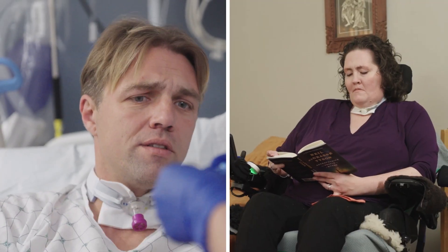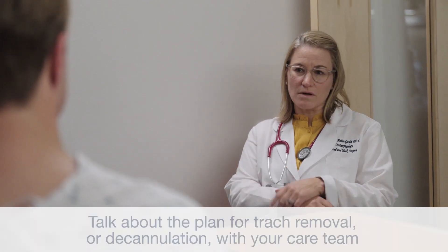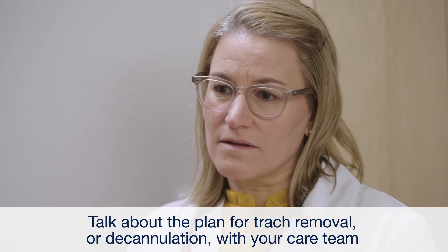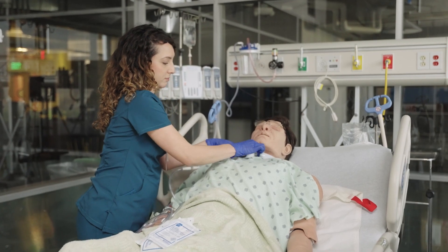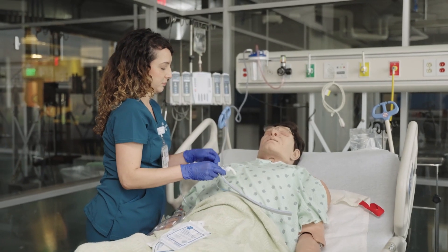Many patients may only need their trach for weeks to months, while others may need the trach for the rest of their lives. Every person is different, and you must talk about the plan for trach removal or decannulation with your care team. The decannulation process begins if the patient no longer needs the tube to help with breathing, ventilation, or saliva clearance.